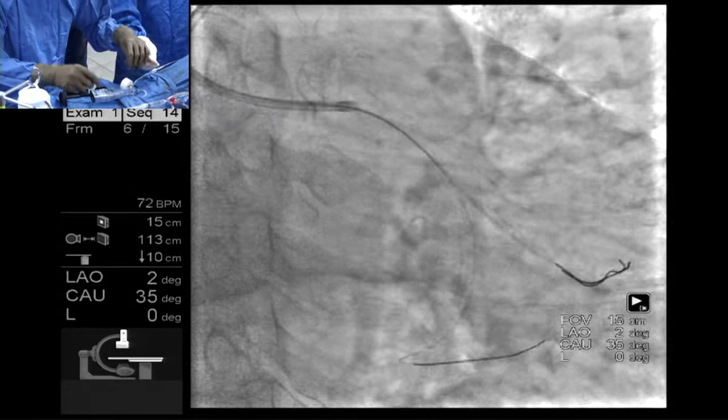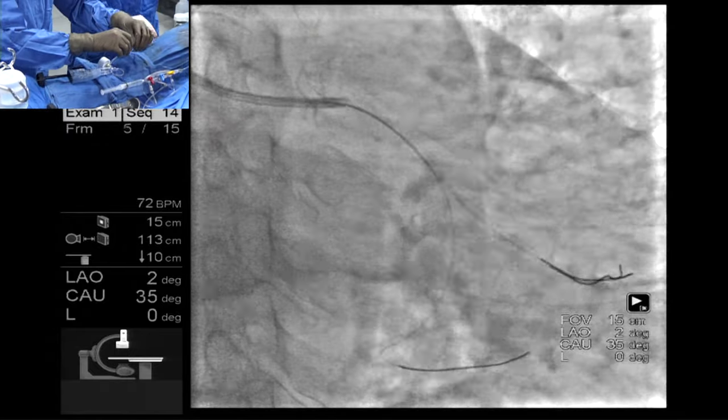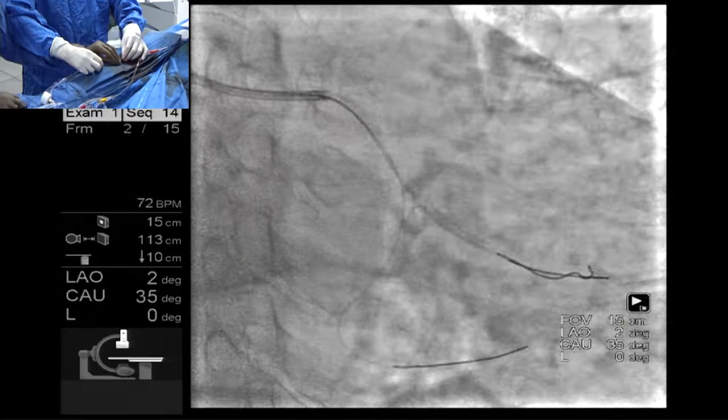In this case, would you image distal to the stent with IVUS, whether it's spasm or hematoma? Oh yeah, I will. I will image everything at the end. At this moment, this patient did not have any EKG change. I think it will be okay. Pressure is fine.